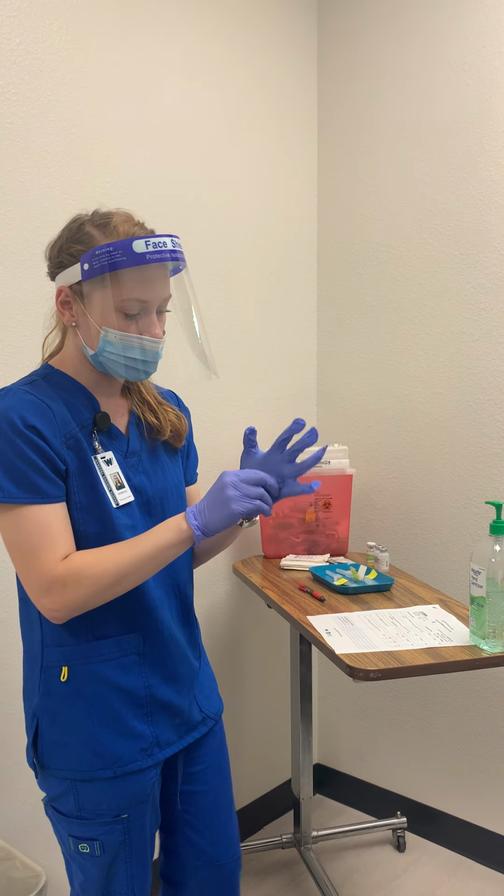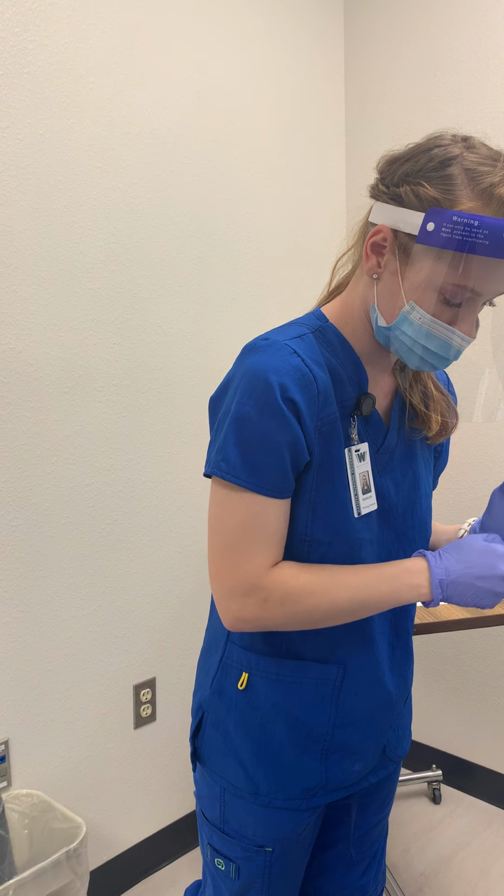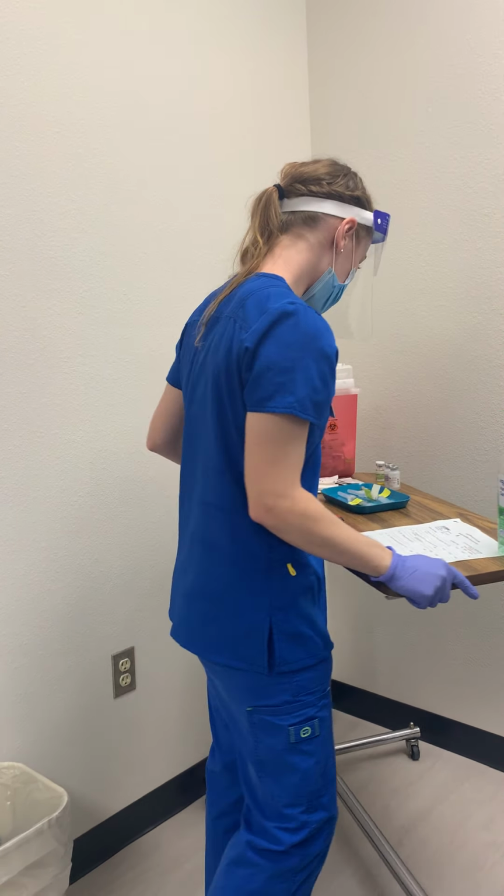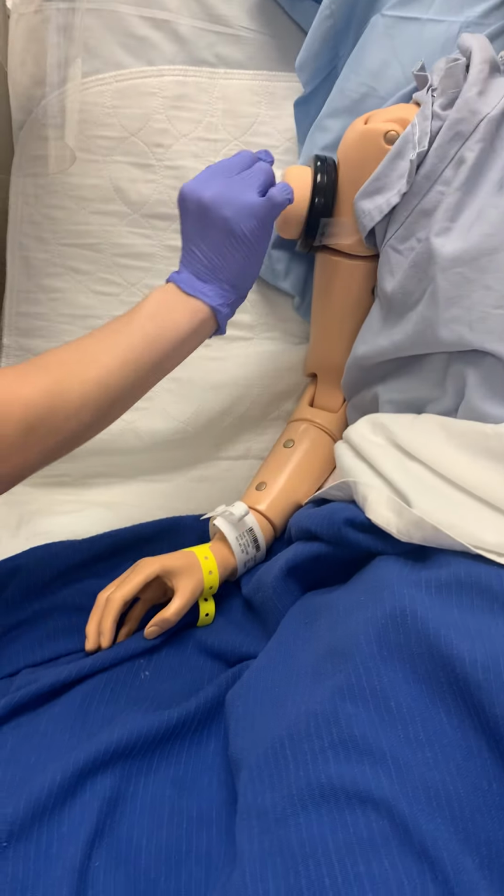Let me get on my glove correctly. There we go. Okay, perfect, Shirley. So Shirley, do you have any questions before I begin? Okay, no? Okay, you're still doing okay? Okay, so firstly, what I'll be doing is your Phenergan. So for nausea, that's going to be a Z-track method. So what I'm going to do is I'm just going to pull this back so I have easier access. And then, let me get my gauze ready. And then I'm just going to be wiping from inner to outer.